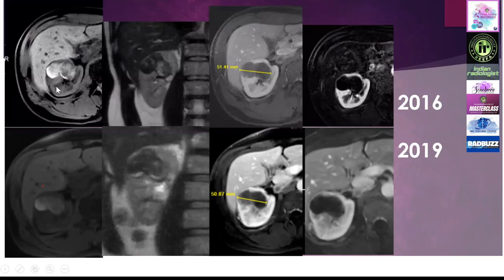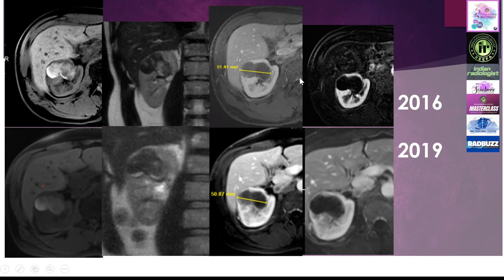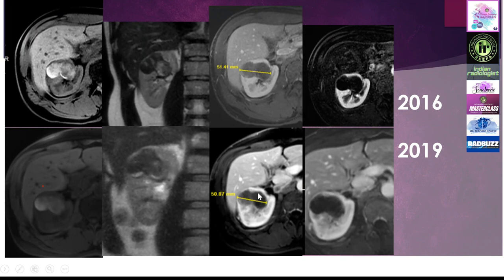This 50-year-old patient showed an ugly-looking lobulated lesion with hyperintensity on T1 pre-contrast. Even on T2-weighted images the lesion looks extremely ugly, but with IV contrast you don't know whether it's enhancing. On subtraction images, you can clearly see this is just a hemorrhagic lesion with no abnormal enhancement. We followed this lesion for three years and there was hardly any change — still hemorrhagic, no enhancement on subtraction, which saved this patient from nephrectomy.